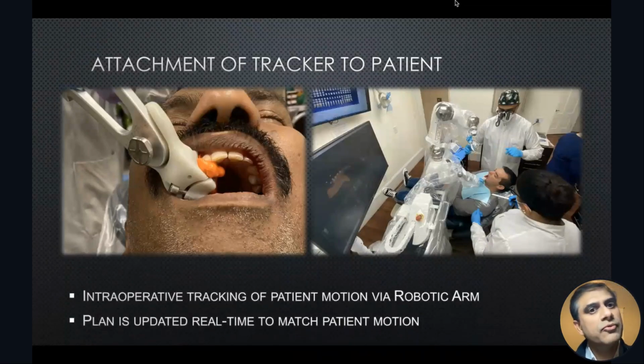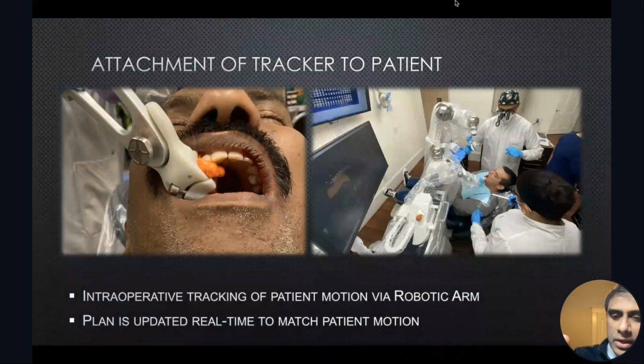I was doing an extraction of number 14. I was doing a combination of a sinus lift and an immediate placement. I'll show you a radiograph of that. And sinus lifts, again, with the robot, are absolutely seamless. And the best part of it is that when you're actually torquing the implant in, the mount is held by the robotic arm, and the handpiece securely places it into the sinus. It is so secure. There's a lot of safety in there because you're not going to dislodge the implant into the sinus, which is one of the biggest nerve-wracking experiences you may ever have.